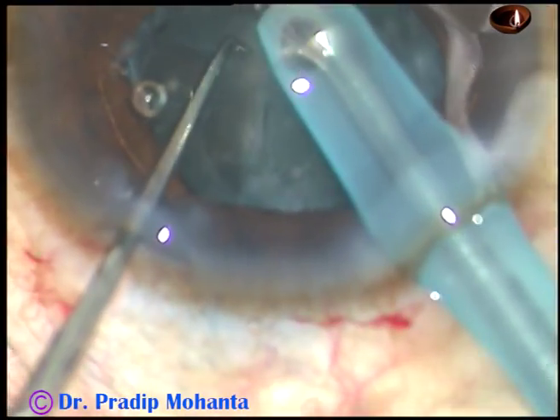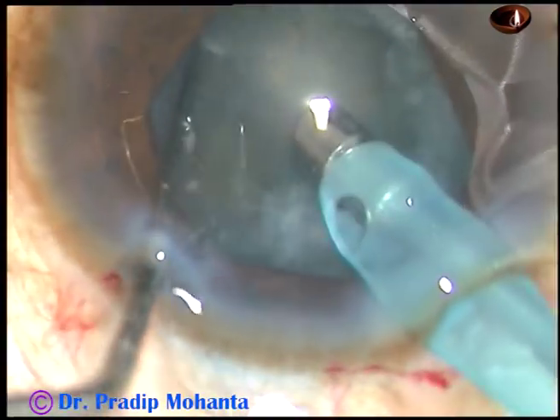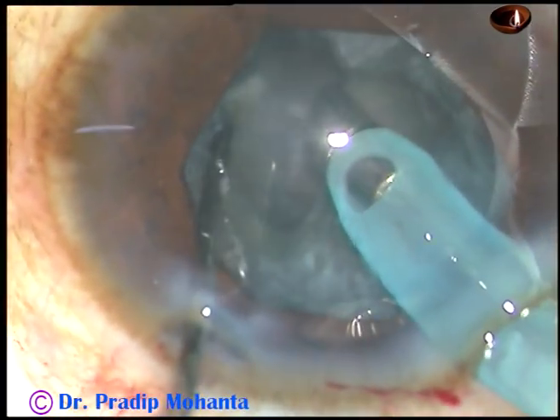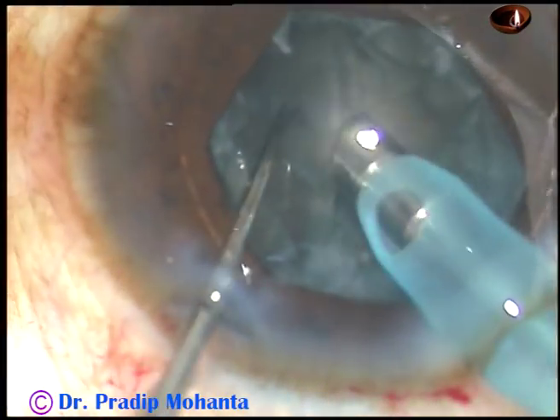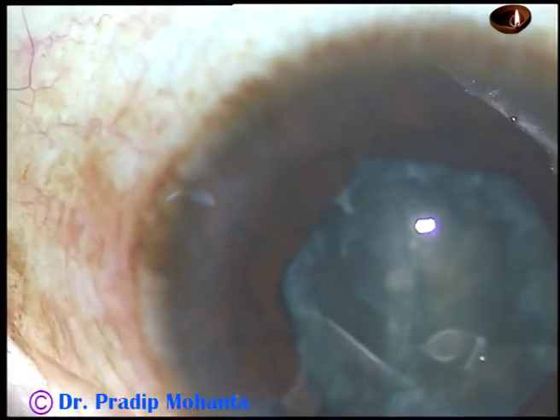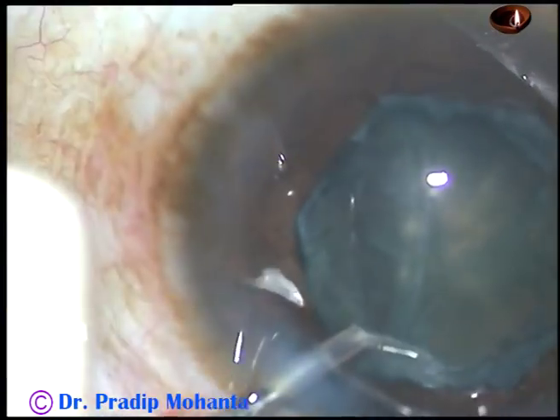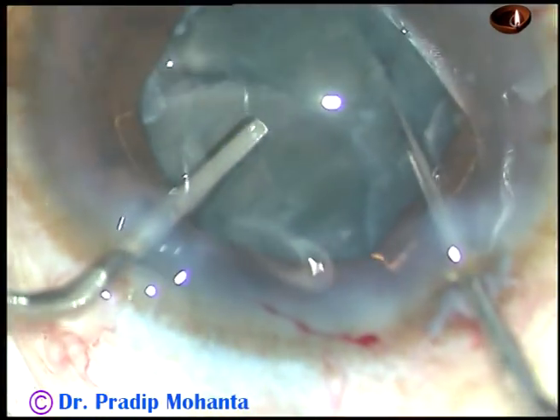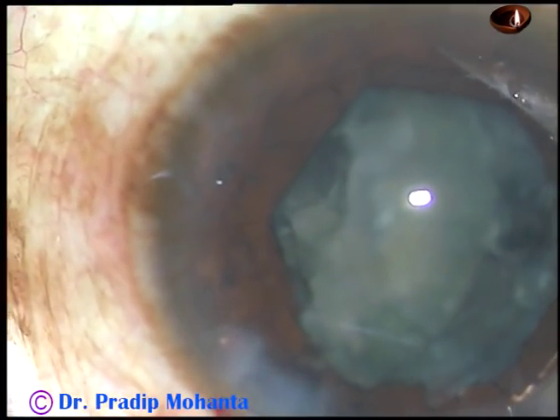Again, I go into the anterior chamber and I am trying to hold the inner edge of one heminucleus. I am trying to separate the two — yes, I have separated it. But as I place at the inner edge, some nuclear piece came out; it was just shaving of the nuclear mass and I could not lift it up. So I come out again, inject some viscoelastic, and a viscocannula is introduced through the side port for fixation. I take the chopper and rotate the whole nuclear mass until this fragment could be prolapsed.